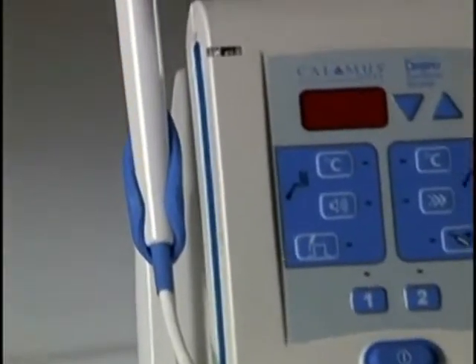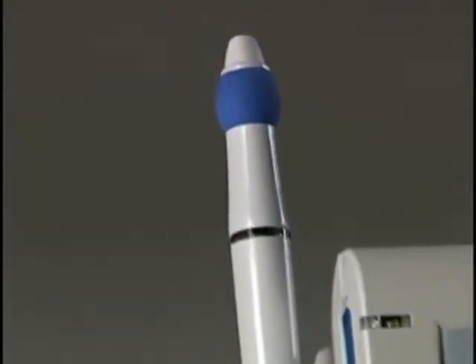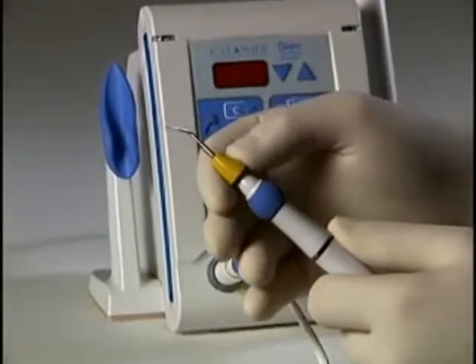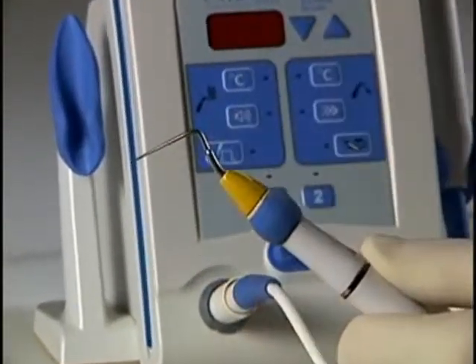Operation of the Calamus pack handpiece is simple and intuitive. With the unit off, the electric heat plugger or EHP tip is inserted into the pack handpiece and slowly rotated until it locks into place.